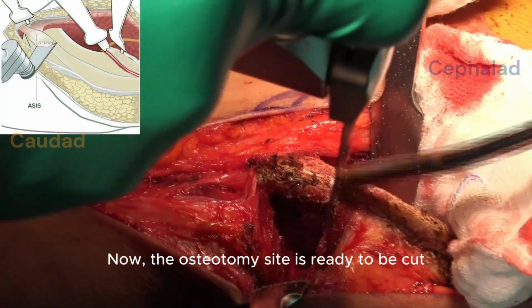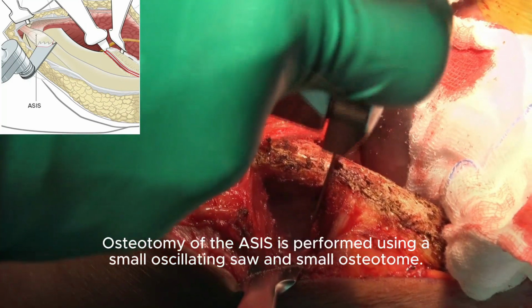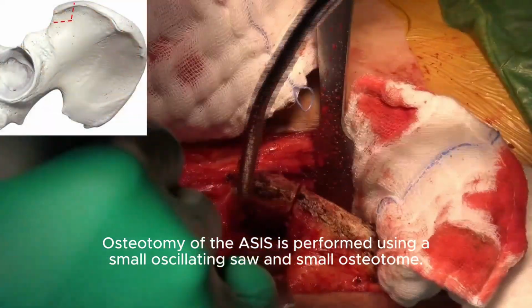Now, the osteotomy site is ready to be cut. Osteotomy of the ASIS is performed using a small oscillating saw and small osteotome.